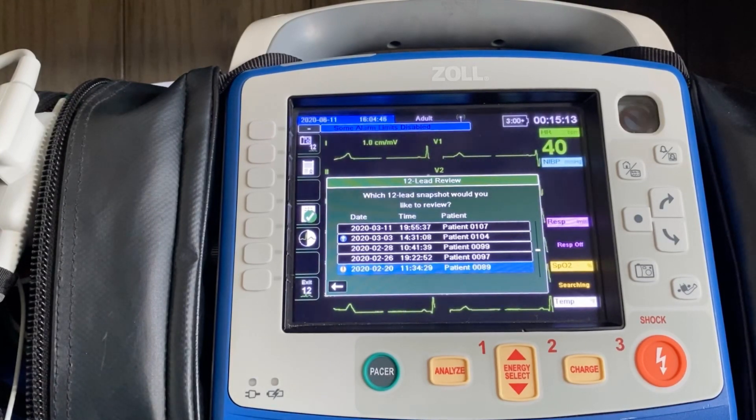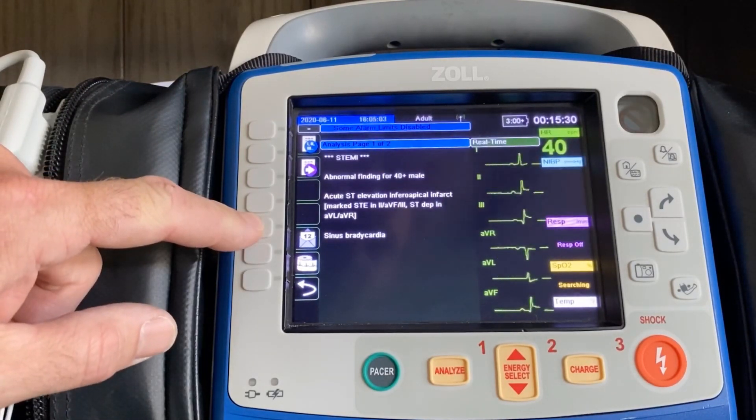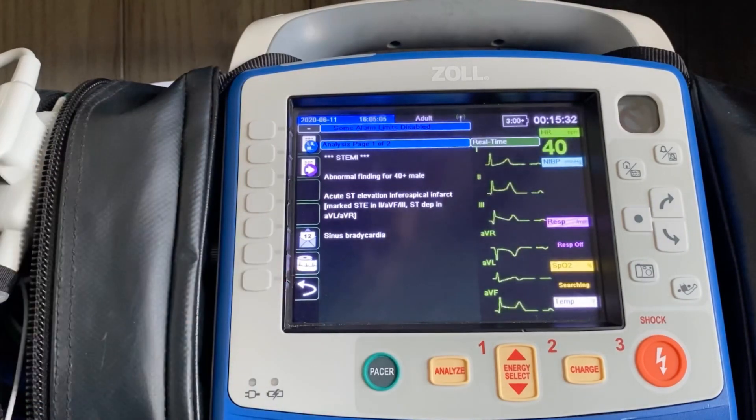At that point, you could either ask the hospital staff if they want you to transmit it again so they have it electronically, or if they would just like you to print a copy. By pressing the enter button, it brings you back as if you had just acquired the 12-lead on the patient. You can either transmit it like we looked at before, or you can print it off by hitting the printer roll.